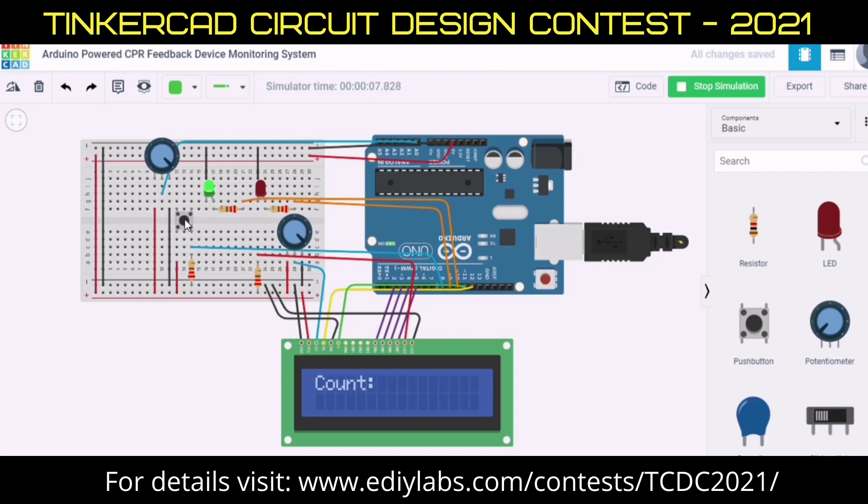Here the LEDs are connected to the button. When the chest is pushed down to the correct depth, it activates the button and the green LED. If they do not push hard enough, the button is not depressed and the red light is activated.